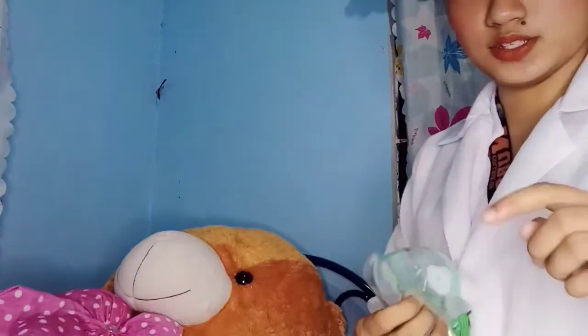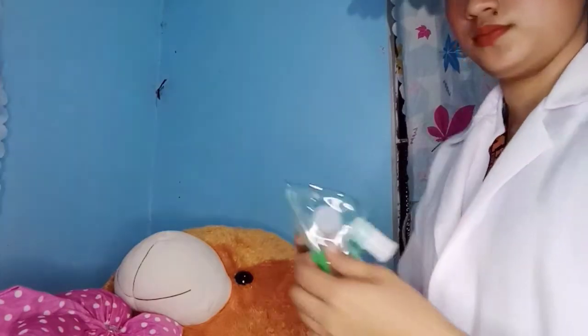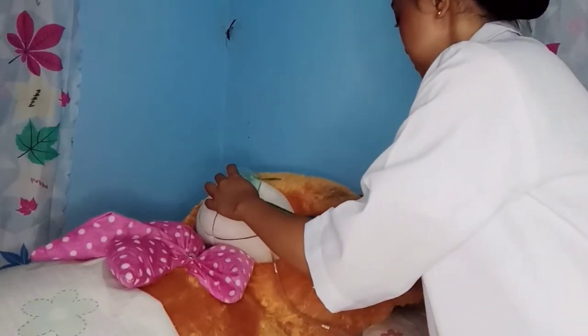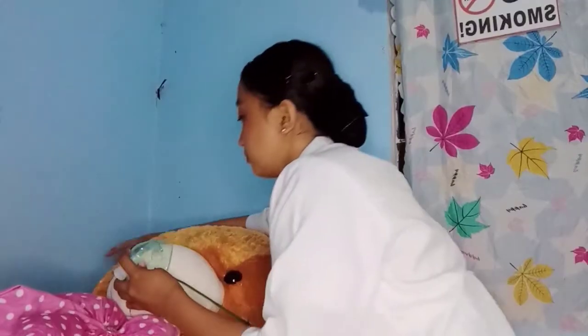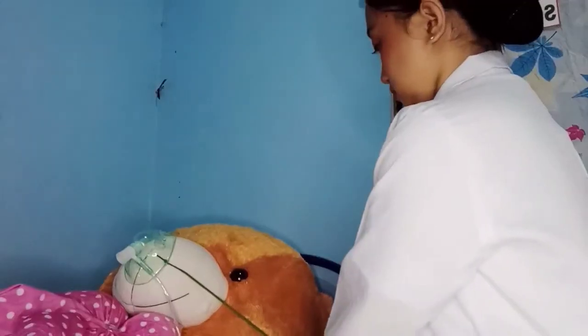And then next, position the face mask over the patient's nose and mouth. As you can see, ito yung panglagay sa nose. So ma'am, paki-close po yung mouth. Then adjust the elastic strap so that the mask fits snugly but comfortably on the face.